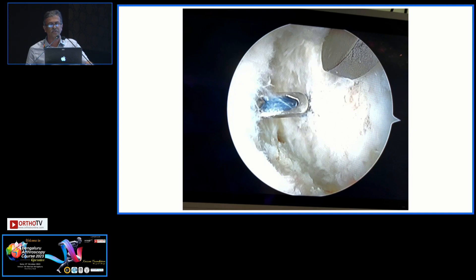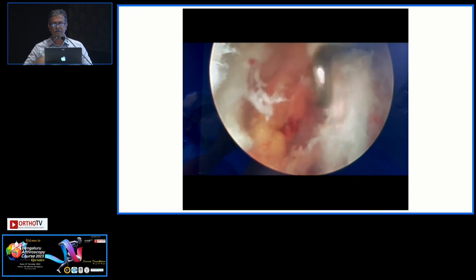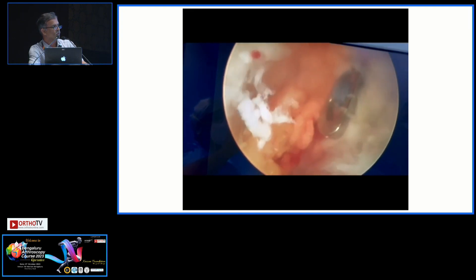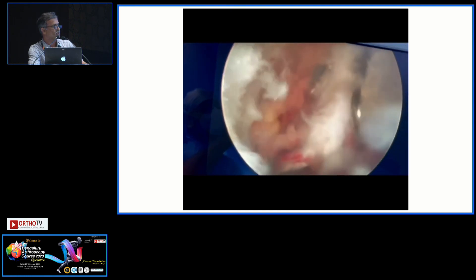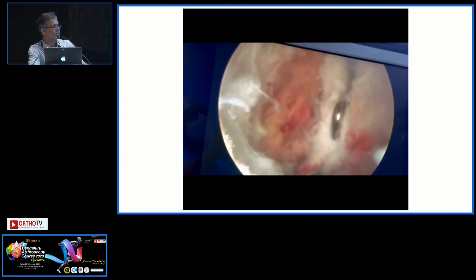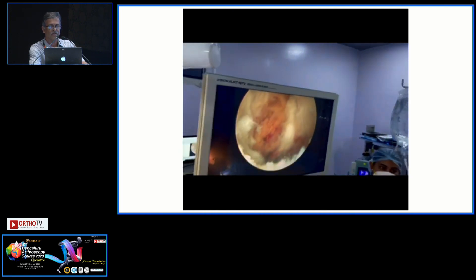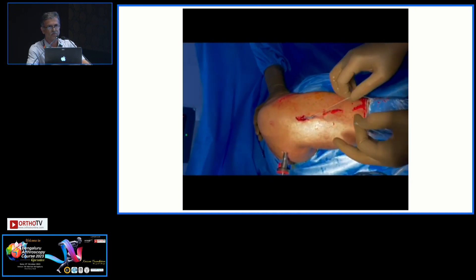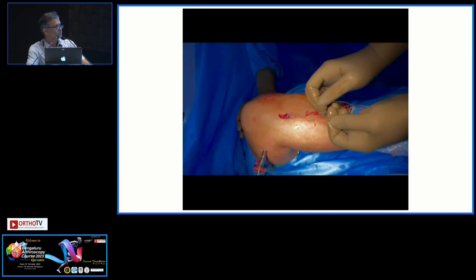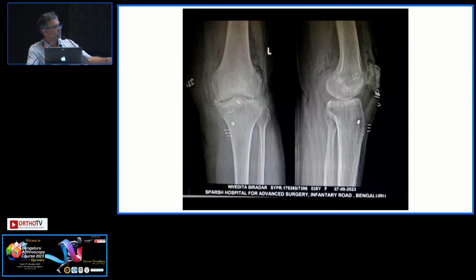The button is deployed, and before you tighten, somebody should apply a good anterior drawer thrust. The intraoperative view shows the button sitting on the fragment — you can appreciate the fragment getting reduced as I manipulate with my probe. Once I tighten the button, it is held very nicely. Till you tighten it, somebody maintains the anterior drawer. Of course, selection of cases is very important — the fragment should be quite good enough to accommodate the button. The post-operative rehab is the same as for PCL reconstruction or PCL avulsion fixation. That is the post-operative picture.